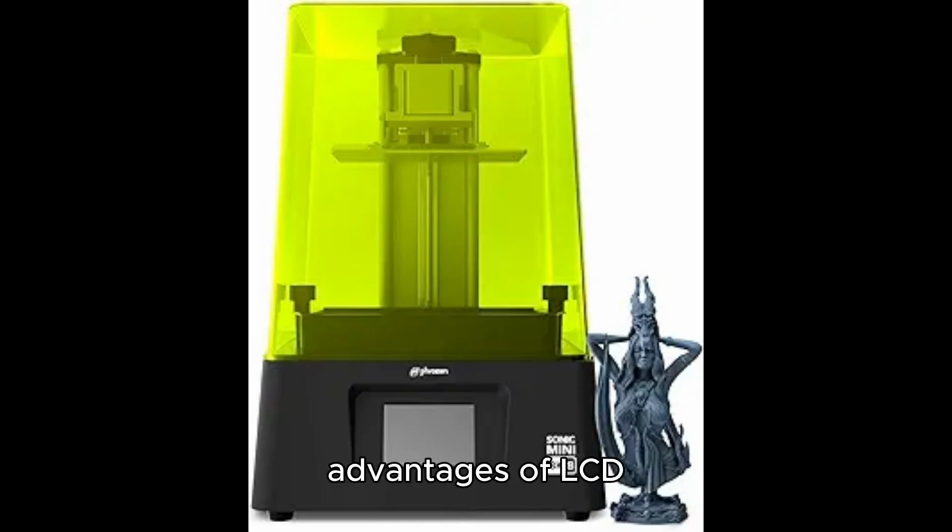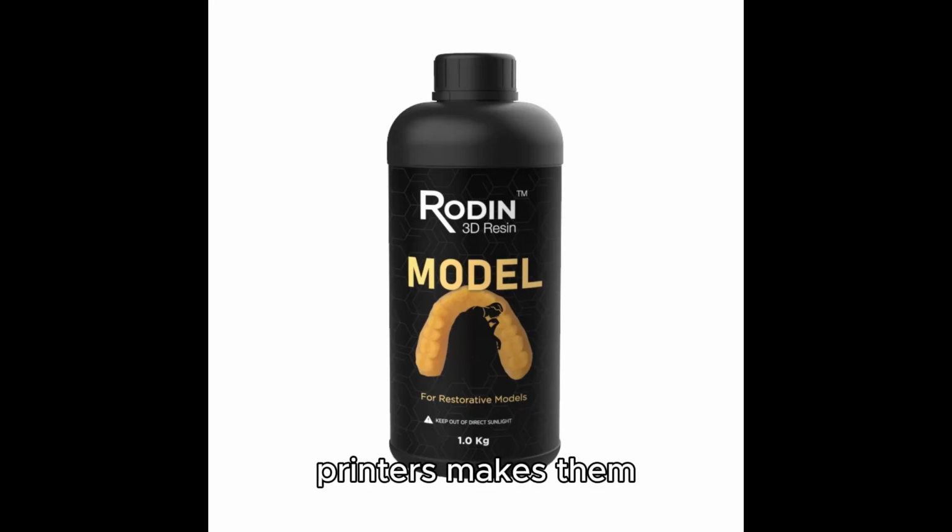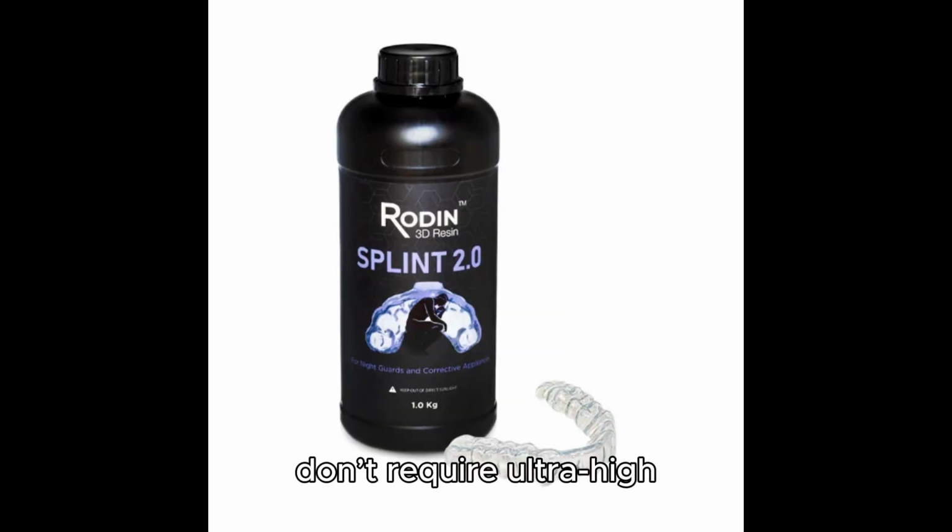One of the main advantages of LCD printers is their lower cost. This type of printer can be an excellent starting point for practices looking to enter the field of digital dentistry without a large initial investment. The affordability of LCD printers makes them accessible to smaller practices or those that don't require ultra-high resolution.